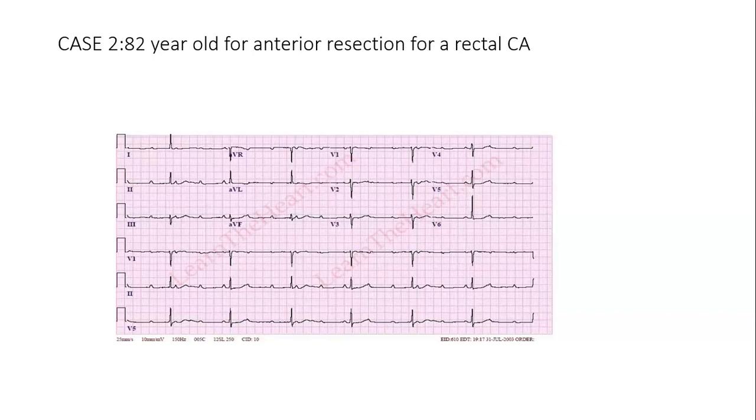Okay, why? Because I think the patient needs optimization, so I'd send for a cardiology consult. For what? For pacing, I think the patient might benefit from pacing. Okay. So the patient is coming for semi-elective surgery, so it's not urgent, and the patient needs to be paced.